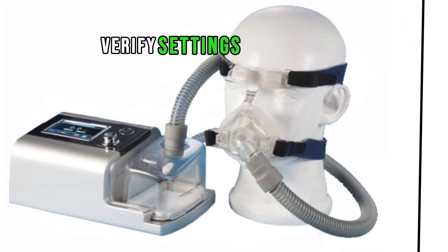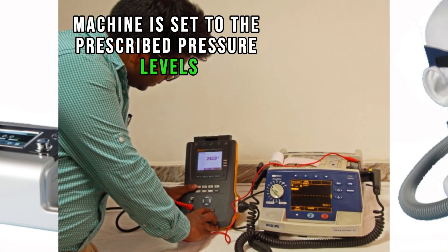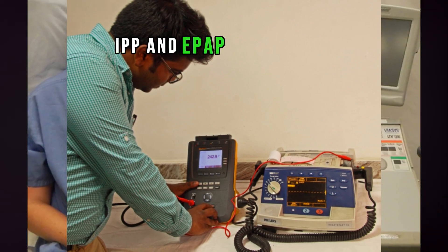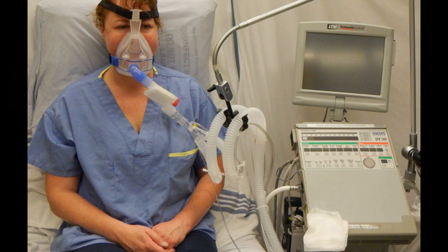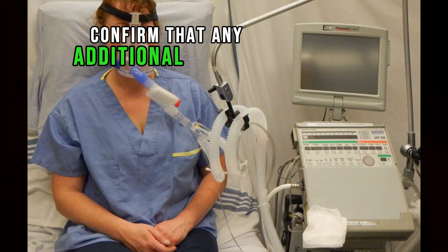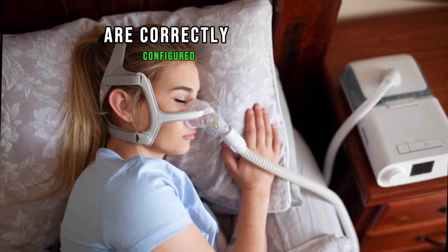Verify settings. Ensure that the BiPAP machine is set to the prescribed pressure levels — IPAP and EPAP — as recommended by your healthcare provider. Confirm that any additional settings, such as ramp time or humidification, are correctly configured.